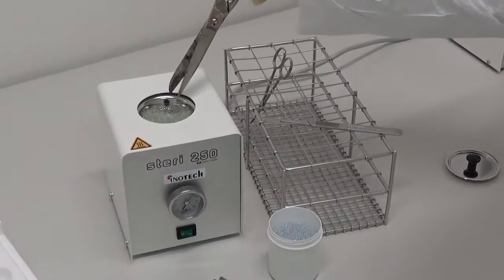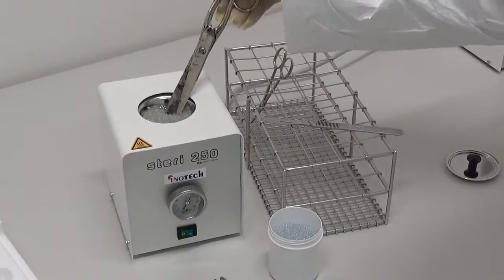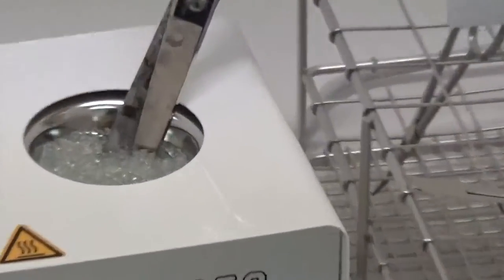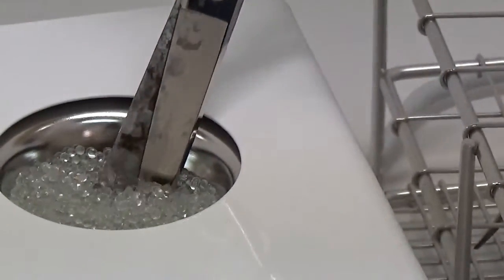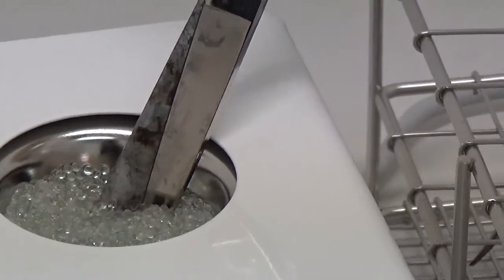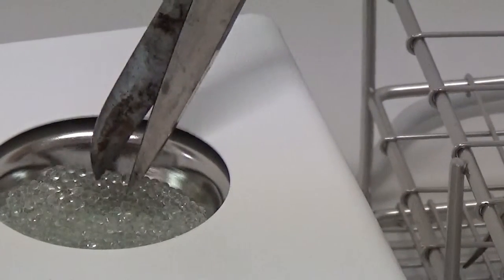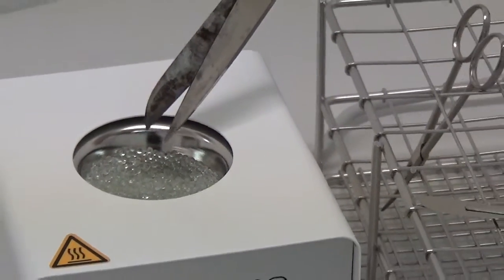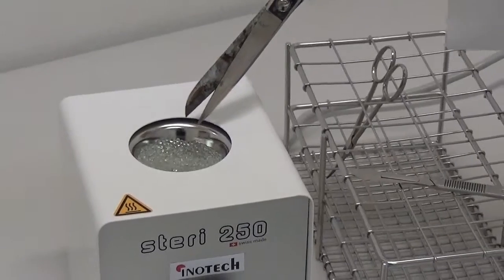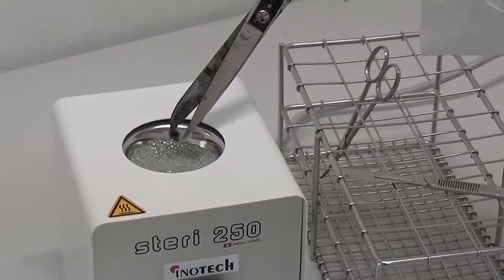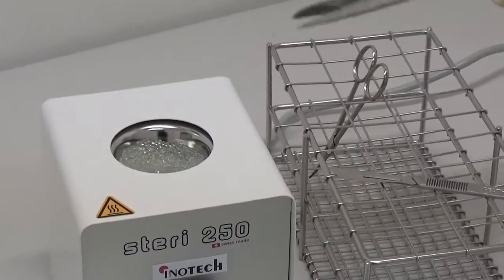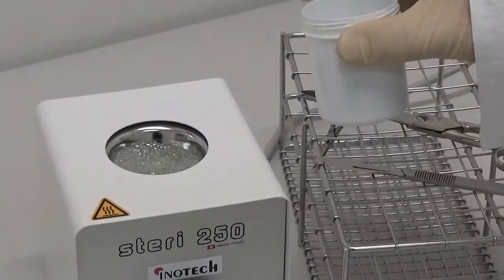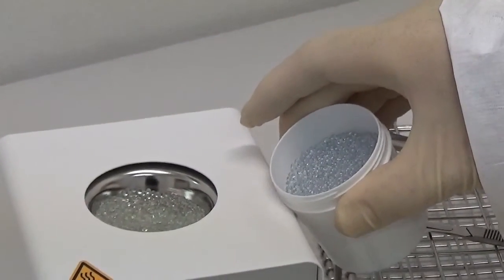When you insert dirty instruments into the sterilizer, the dirt will be baked on the instruments and stick to the beads. Beads which have a deposit on it will turn brownish and do not transfer heat as efficiently as necessary. It is therefore recommended to replace the glass beads when they become discolored.